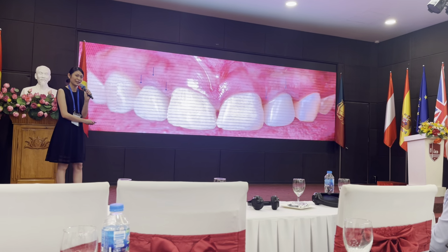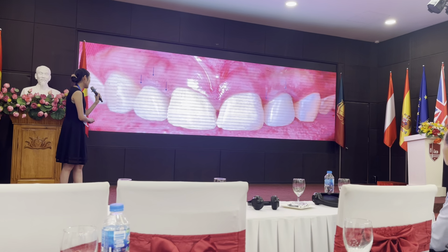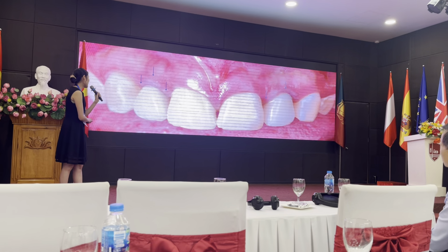Tooth number 7 and tooth number 10. They are both dental implants. Răng số 7 và răng số 10, hai răng cửa bên. This is the final crown. Các bạn có thể nhìn thấy đây là cái khung hình sau cùng.